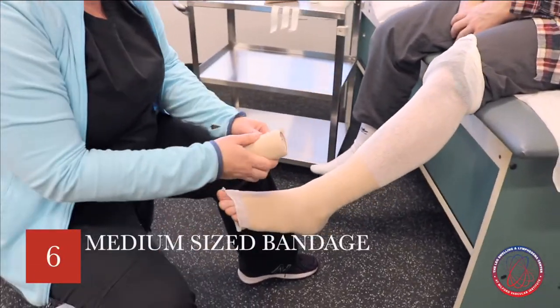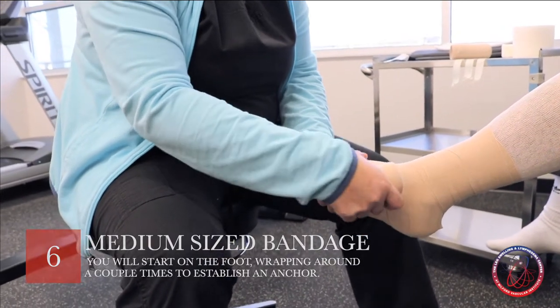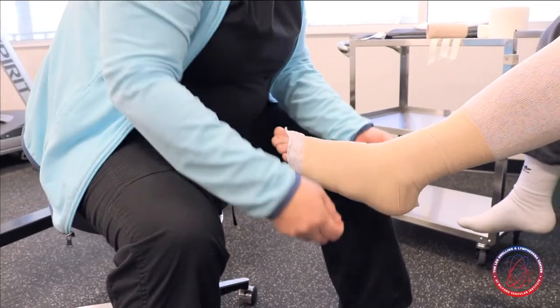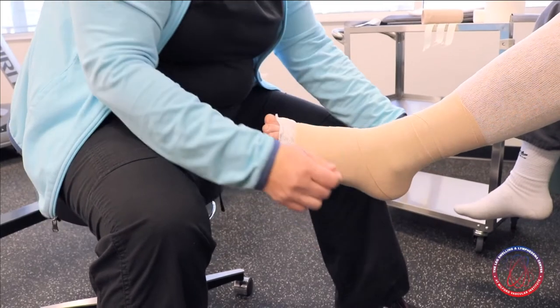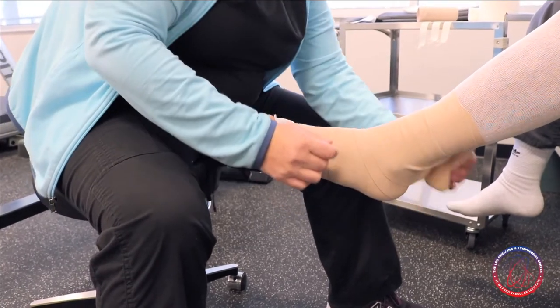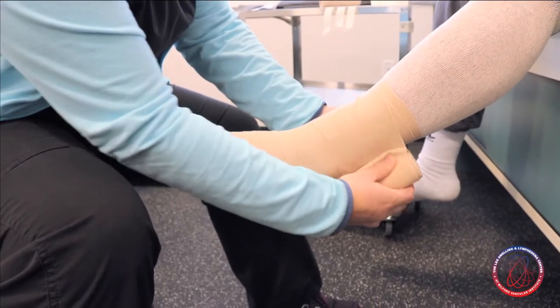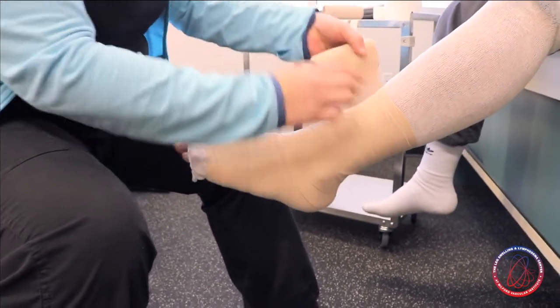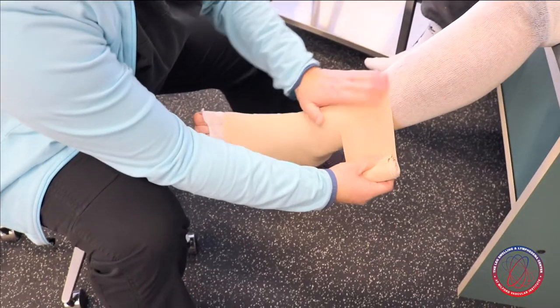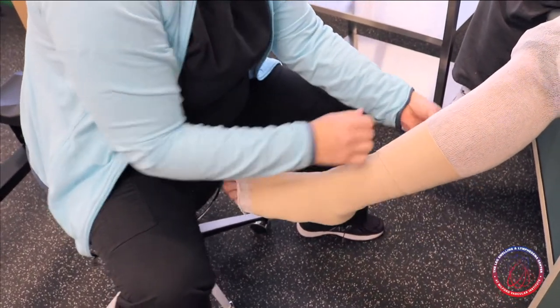The second bandage is also going to start on the foot. We bring it around again, anchoring it with our first pass, and then work our way up the foot and ankle. When we get to the ankle, we start that figure-eight or herringbone pattern — bringing it up, around, and down again, overlapping by about half, pulling the bandage just to take the stretch out. I use my other hand to make sure it's staying flat against the skin. This one will take you a little bit further up than the first one.